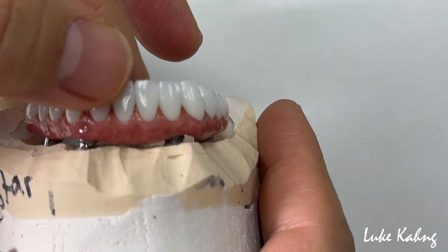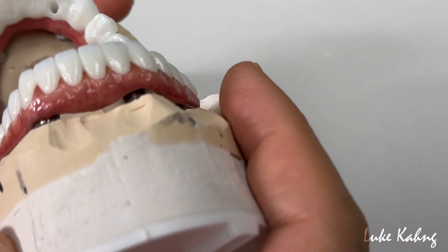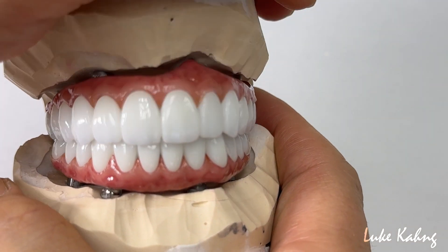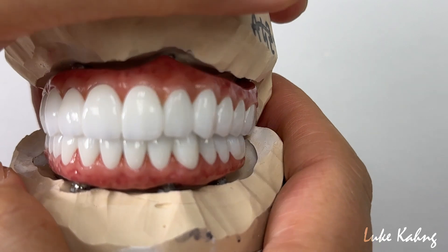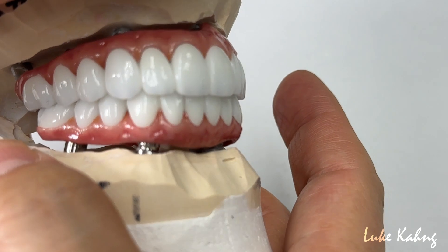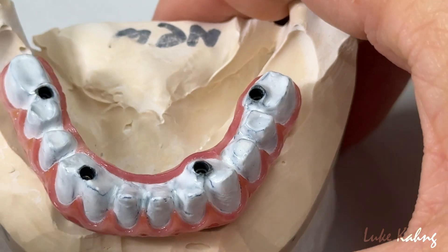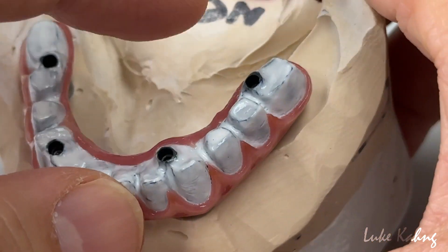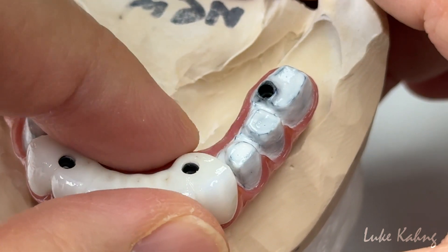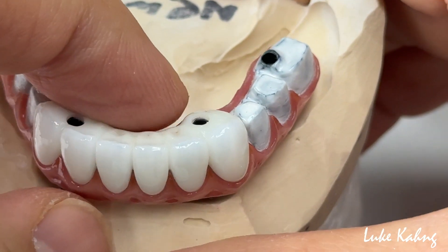And I start to grind a lot — it's a really good piece. This is the final restoration. You can get this kind of pure white, and aesthetically it's much better. Another challenge was after we designed it — it was really tall. We just covered that area to get more smooth. Using the tongs, it got a better smooth, slim shape. This is another tip as well.